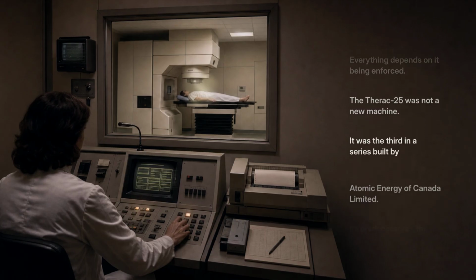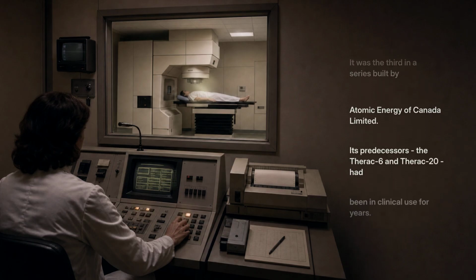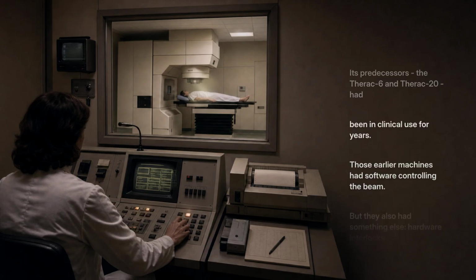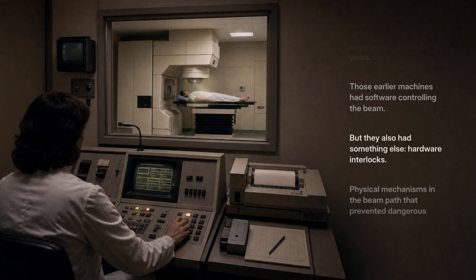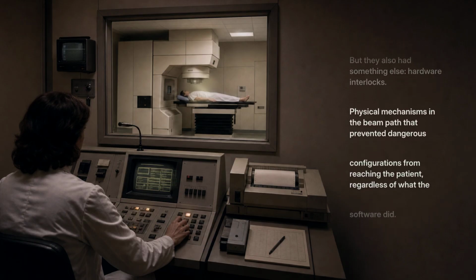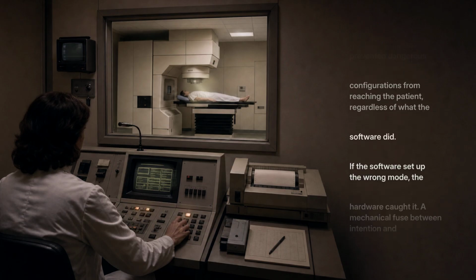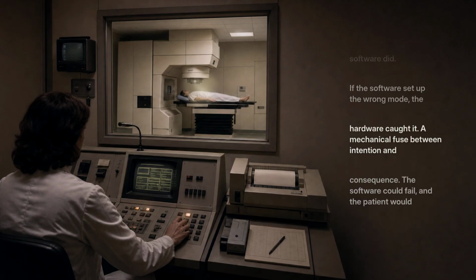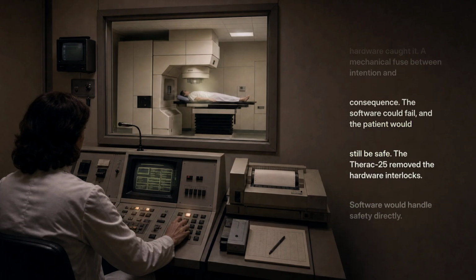The Therac 25 was not a new machine. It was the third in a series built by Atomic Energy of Canada Limited. Its predecessors, the Therac 6 and Therac 20, had been in clinical use for years. Those earlier machines had software controlling the beam, but they also had something else: hardware interlocks. Physical mechanisms in the beam path that prevented dangerous configurations from reaching the patient, regardless of what the software did. If the software set up the wrong mode, the hardware caught it. A mechanical fuse between intention and consequence. The software could fail, and the patient would still be safe.